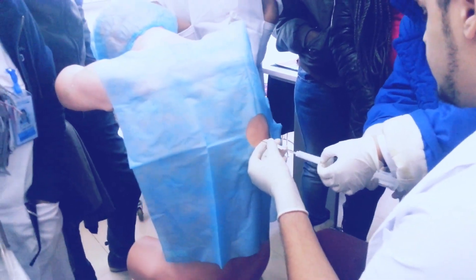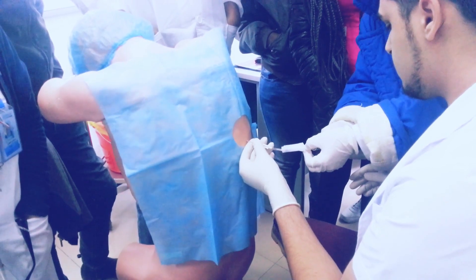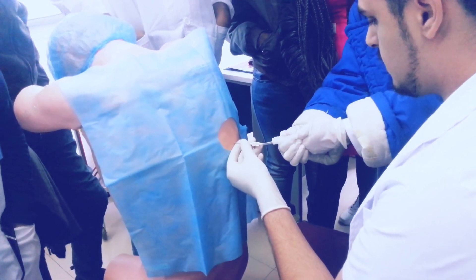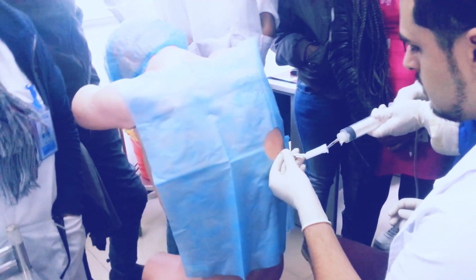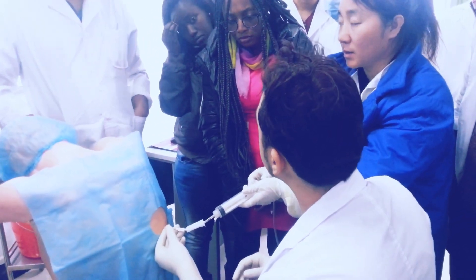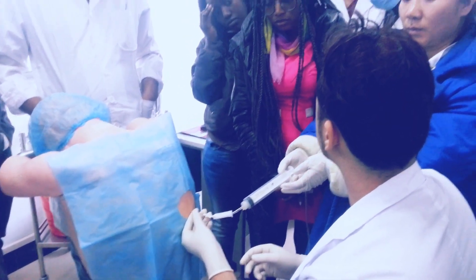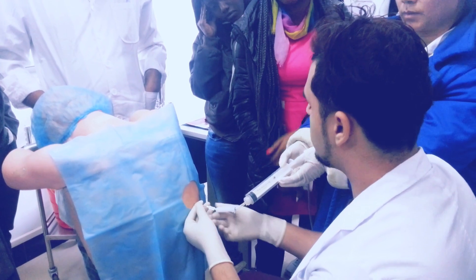I will attach the syringe — like this. And open the regulator. After that, a fluid will come out. But in one time, you cannot take more than 1500 cc, because it will cause pulmonary edema. If you take more than 1500 cc at one time, it will cause pulmonary edema. So we don't take more than 1500 cc.